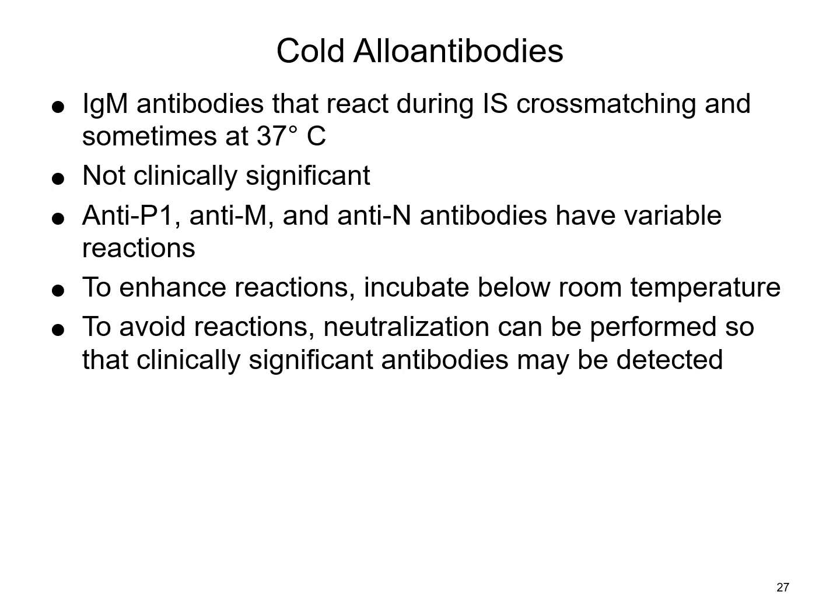To enhance those reactions, you could lower the incubation temperature. I have done this before where I'm suspecting a cold antibody, but I'm not quite sure. So what I'll do is rerun that panel, but instead of incubating it in the 37-degree incubator, I'll let it sit at room temperature, or I've even placed those tubes or gel cards in the refrigerator and let them incubate for that 10 or 15-minute period in that cold environment, which will enhance the cold reactivity.